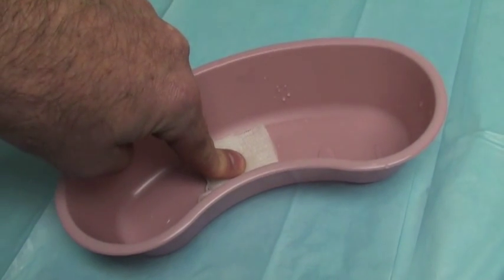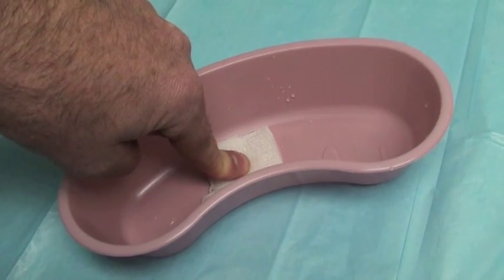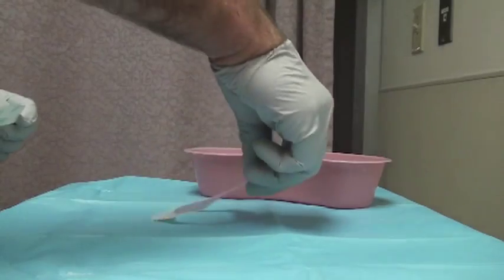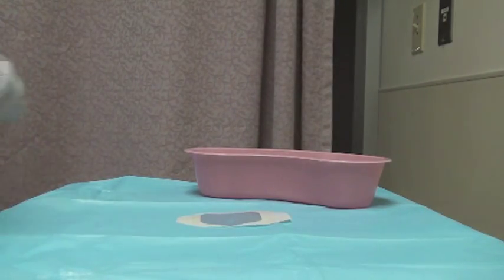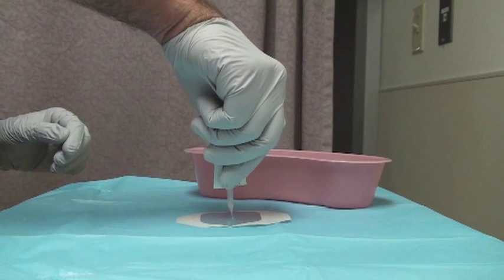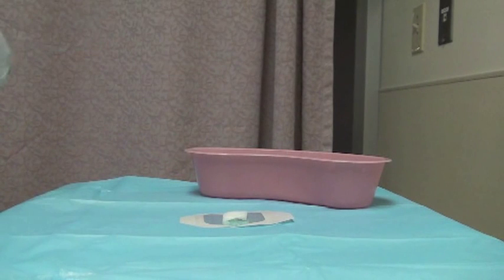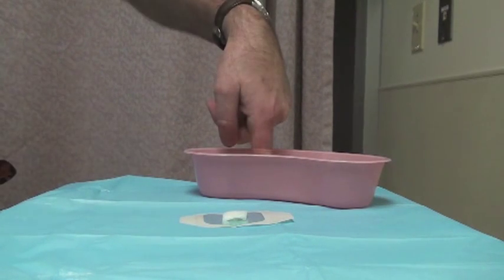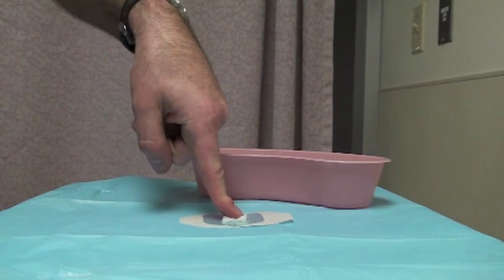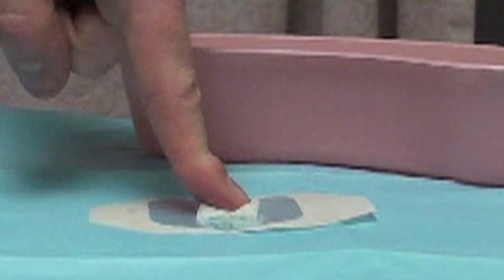Instead of the old xeroform gauze approach, have the patient press the pad injury down on a piece of gauze saturated with aqueous lidocaine. In the meantime, place a tegaderm sticky side up on the procedure table, and then put a small blob of bacitracin ointment right in the center. If you have it, place a little piece of surgicel or gel foam right on top of the bacitracin blob. Keeping the patient's finger pointed down the entire time, have them pick it up and put it right back down on top of the gel foam. The whole goal is to keep blood from running proximally up the finger.